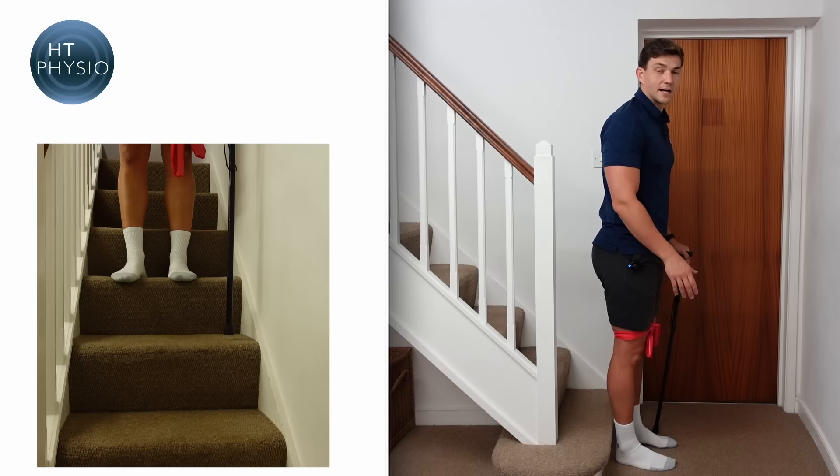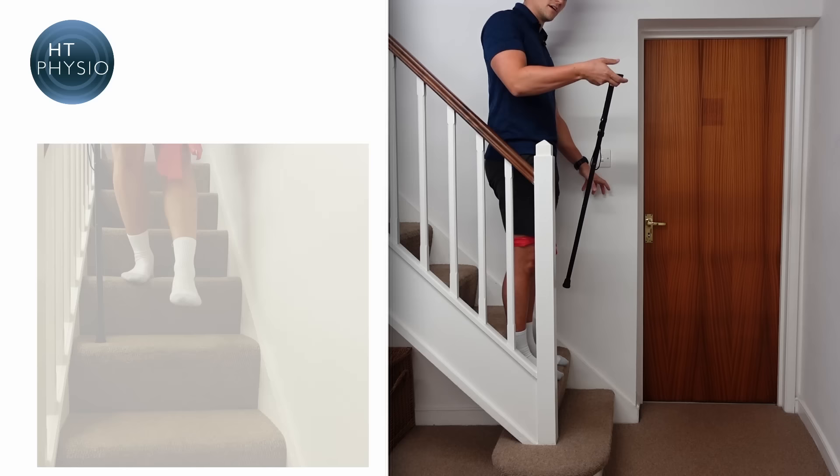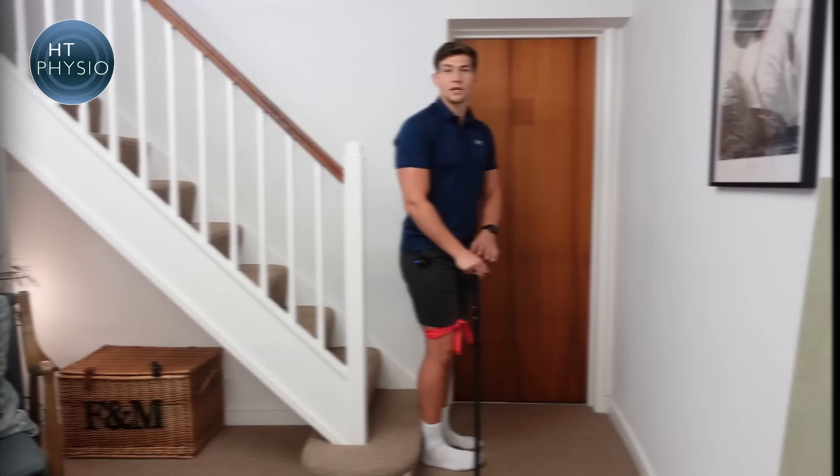Now we'll pretend the banister is on the opposite side — a left-hand banister. The stick swaps hands accordingly. The bad leg is still on the right, so the sequence remains: handrail, stick, bad leg, good leg — repeated for each step down, just like that.